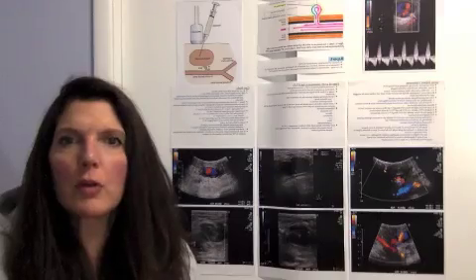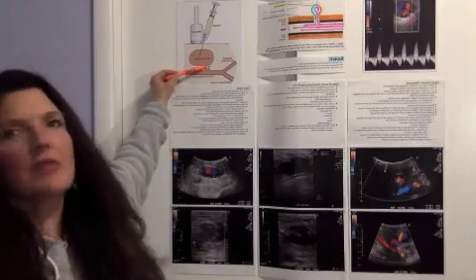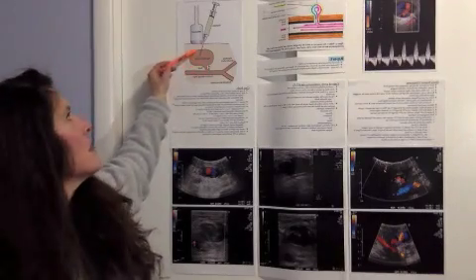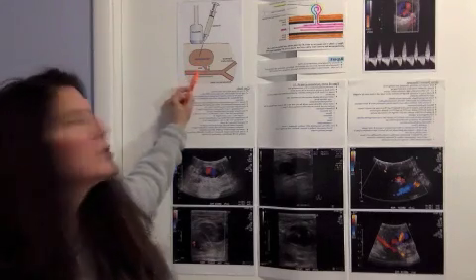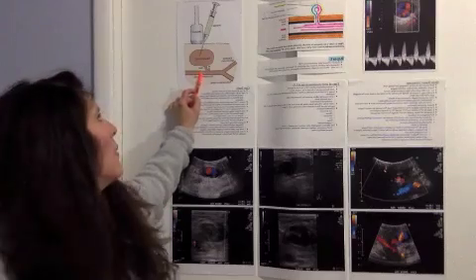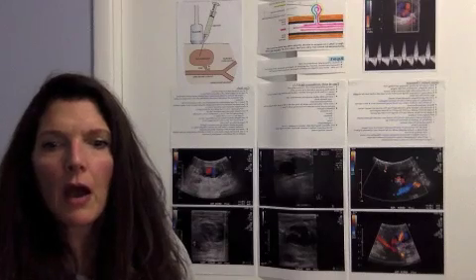It's also important in this case, as you can see here in the picture, to avoid the neck portion, because if you were to inject thrombin into the neck, it could propagate into the adjacent artery and thrombose the artery. So you want to avoid that.